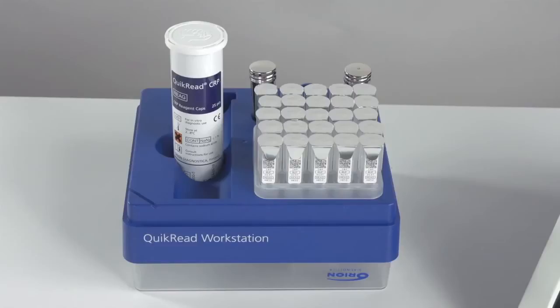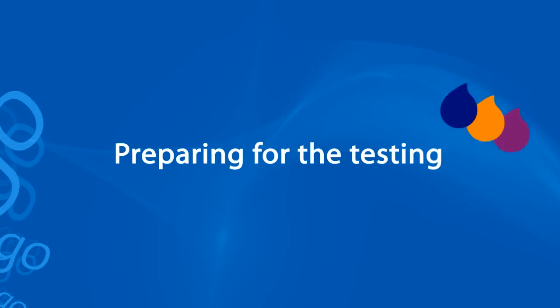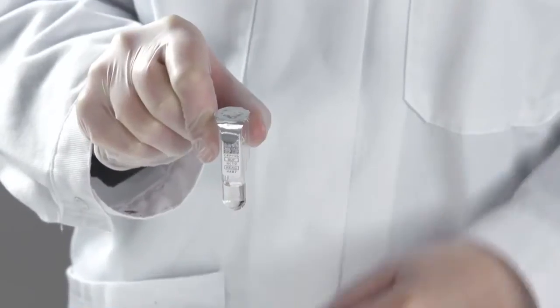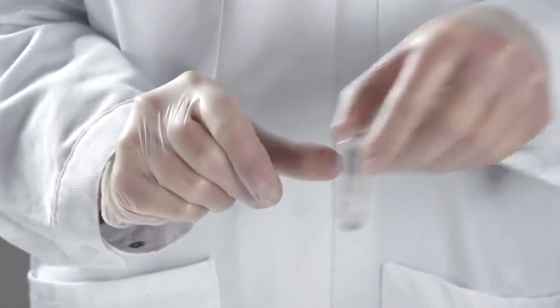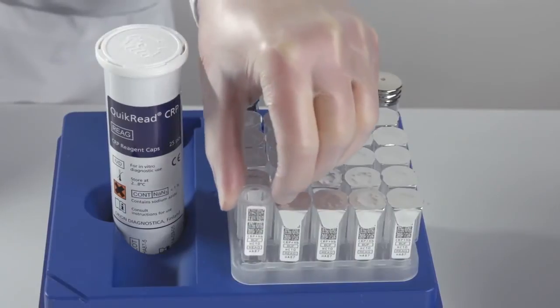The components are easy to use when put into a Quick Read workstation. The workstation is not included in the kit but is available separately. Hold the cuvette from the sides and tear the aluminium lid off. Put the cuvette back into the cuvette rack.